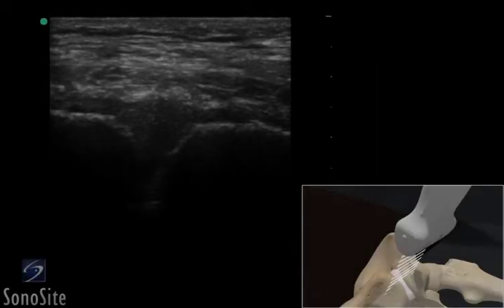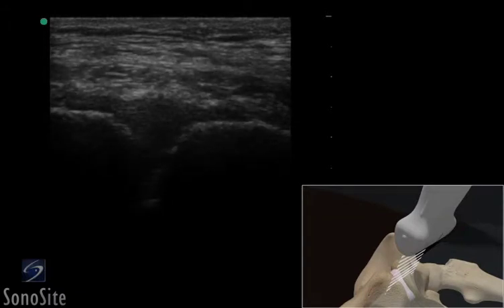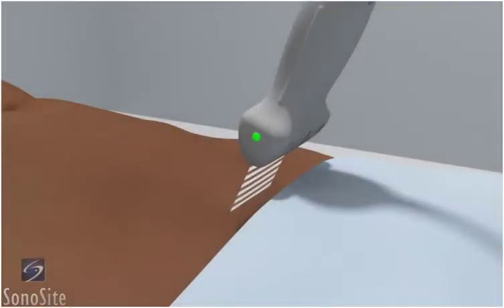A linear array transducer with a musculoskeletal exam type is used to perform an ultrasound-guided injection of the pubic symphysis. The patient is in a supine position.